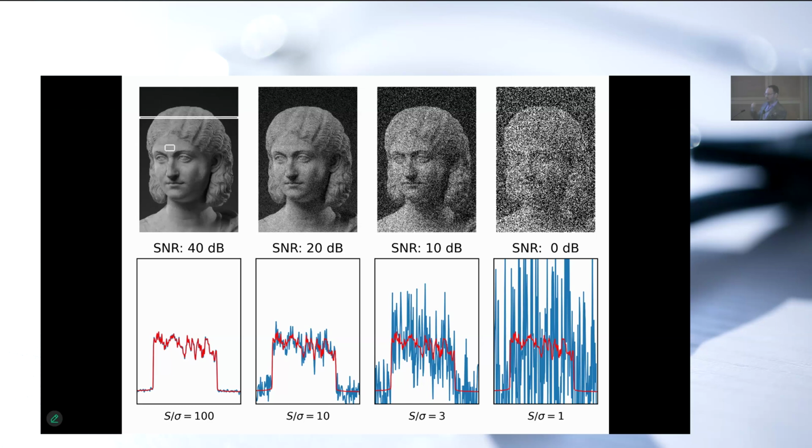So there isn't a large degree of visual interpretation, because of course you all see that this is the same picture. The human brain is wonderful at excluding noise, but machines are bad at excluding noise. So there's still a huge element of human interpretation in EEG for the reason of bad signal to noise ratio.